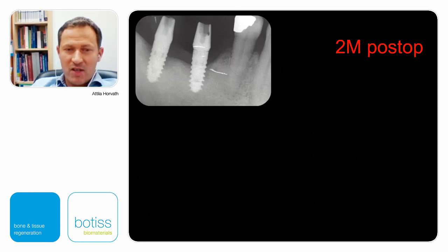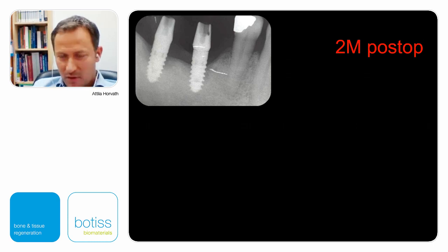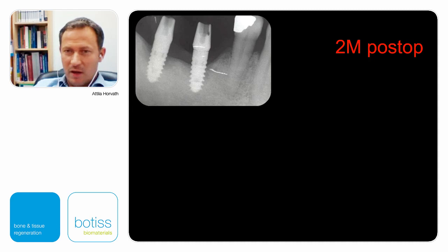So we took an X-ray 2 months postoperatively, and instead of the bone level, which was somewhere there, now we could observe a much higher bone level. So of course it looks delusive, it looks much better. If I had seen this picture in the very beginning, I wouldn't have said to the patient that these implants are for extraction.